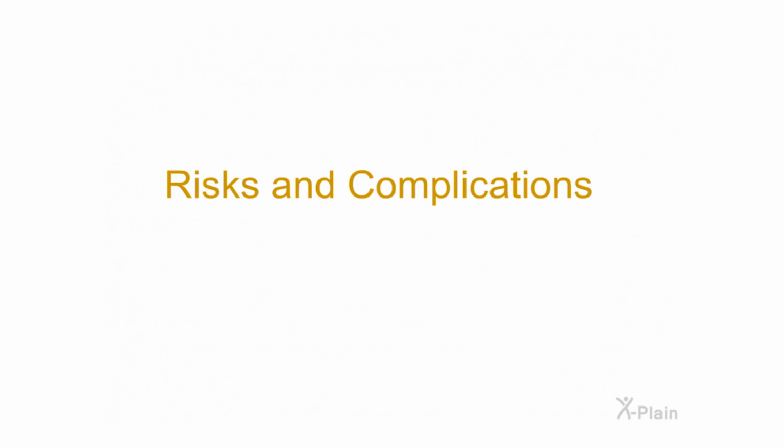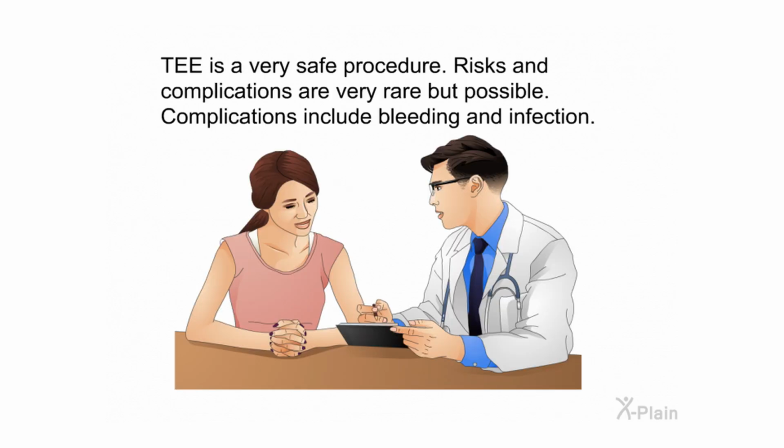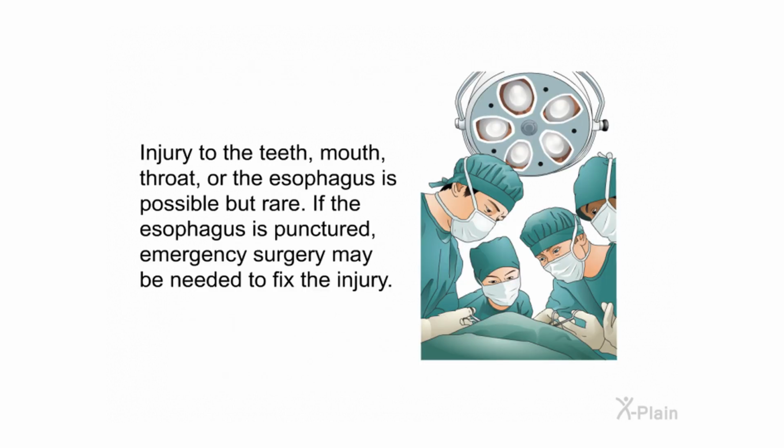Risks and complications. TEE is a very safe procedure. Risks and complications are very rare but possible. Complications include bleeding and infection. Injury to the teeth, mouth, throat, or the esophagus is possible but rare. If the esophagus is punctured, emergency surgery may be needed to fix the injury.